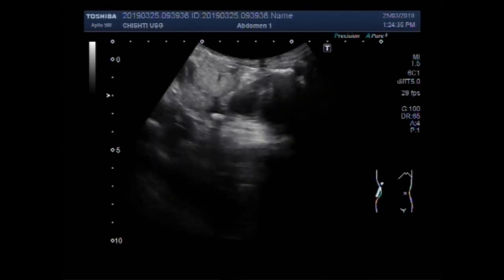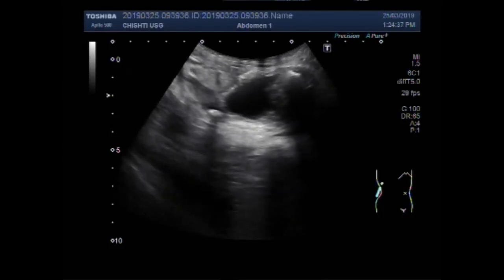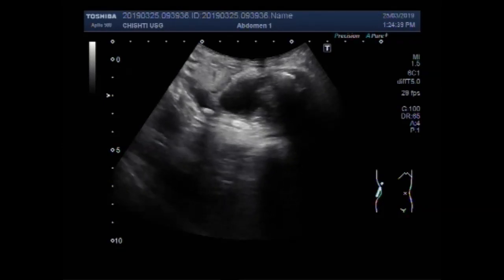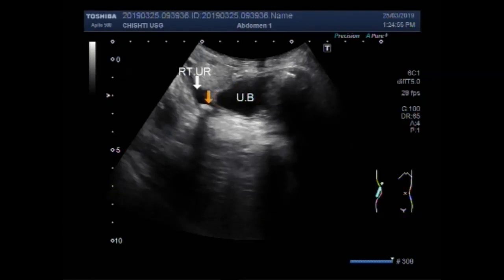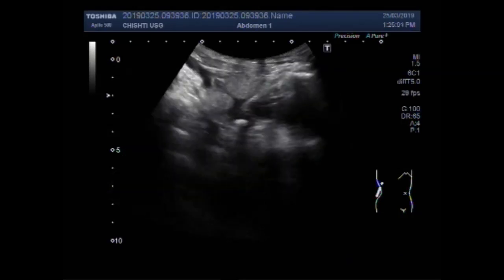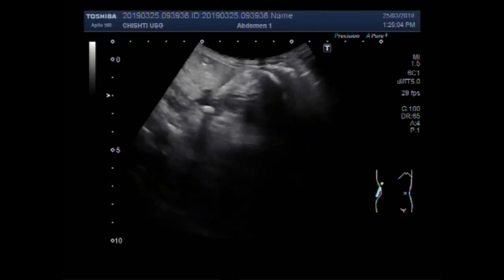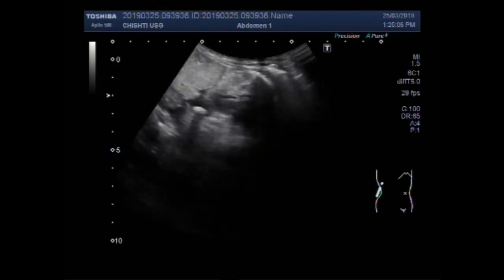And you can see the ureteric stone in the lower one-third of the ureter. This is the right ureter. This is the urinary bladder. And this is the ureteric stone. You can see the stone lies in the lower one-third of the ureter, close to the ureterovesical junction.